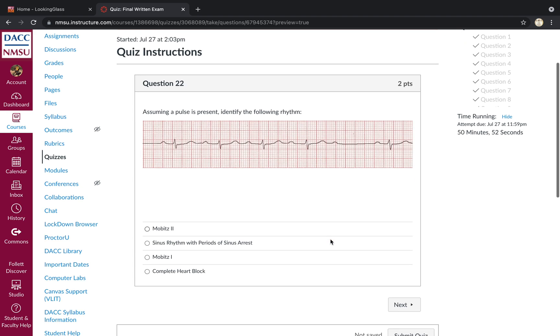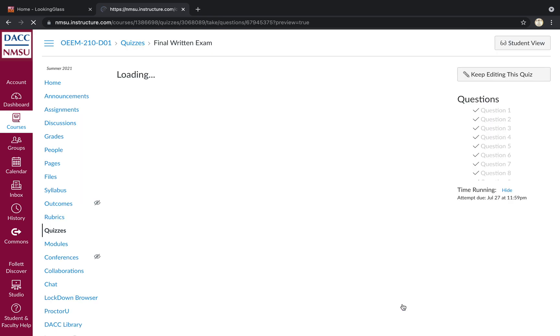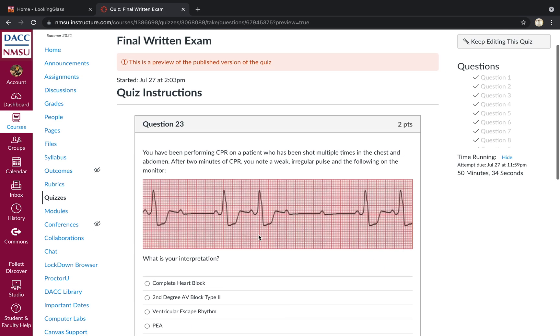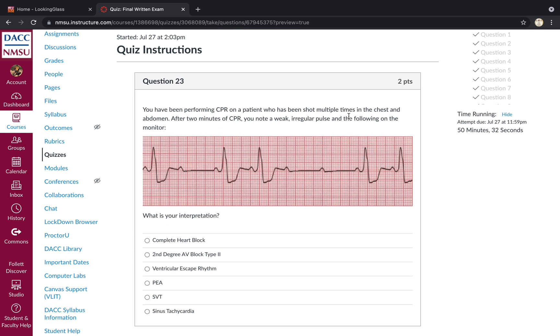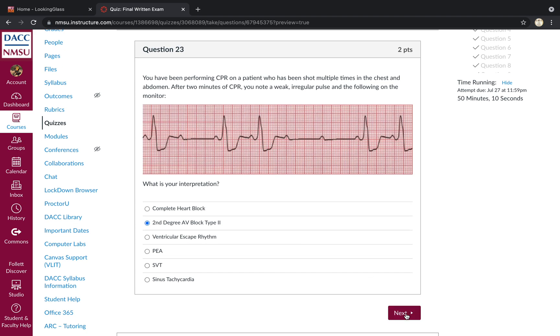Assuming a pulse is present, identify the following rhythm. So we have a progressively increasing P to R interval, followed by a dropped QRS complex. That's classic for a Winkiebock, aka Mobitz 1, aka second-degree AV block type 1. Moving right along. CPR. Patient's been shot multiple times in chest and abdomen. You notice a weak irregular pulse followed on the following on the monitor. What's our interpretation? So you've got consistent P to R interval on normally conducted complexes. Dropped QRS complexes that makes it a second degree AV block type 2, aka Mobitz 2.